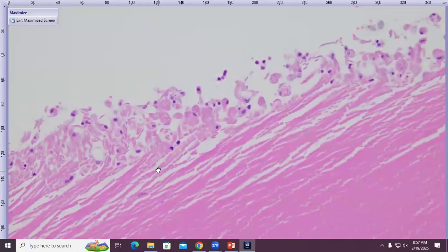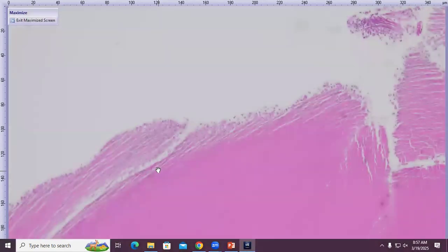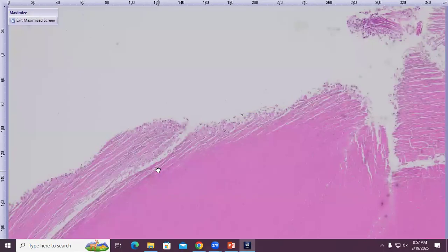The way to describe this is that they're phagocytizing the lens fibers. Sending over to the culinary pathology journal. Yeah. Spaghetti meatballs.